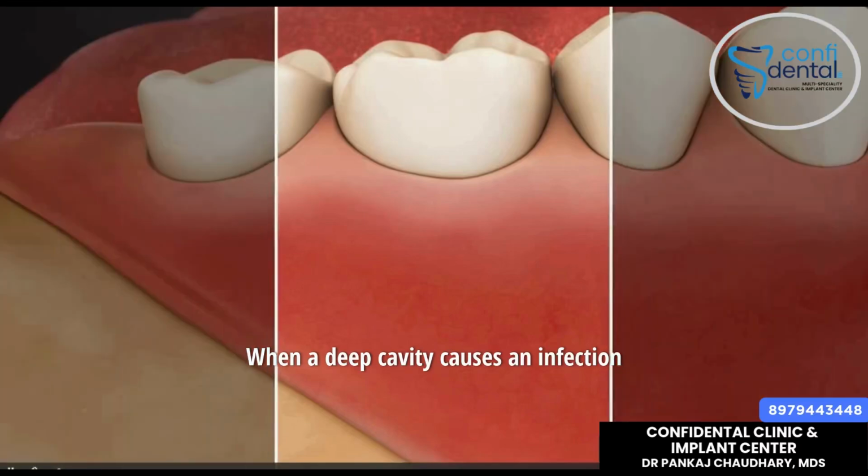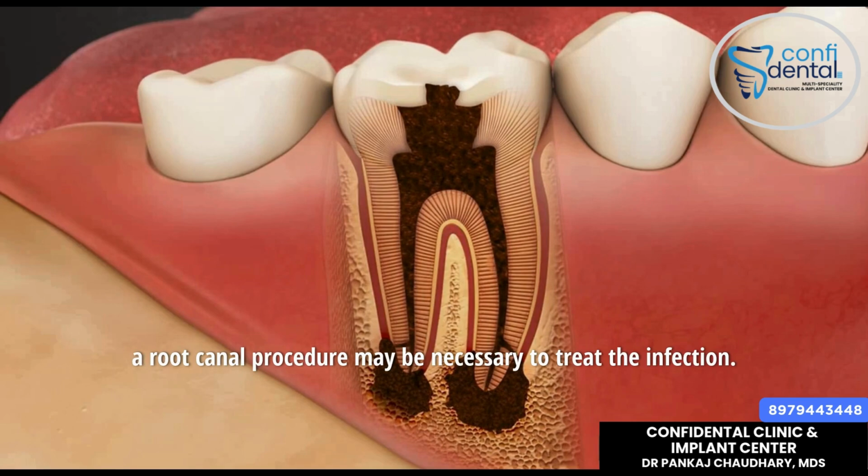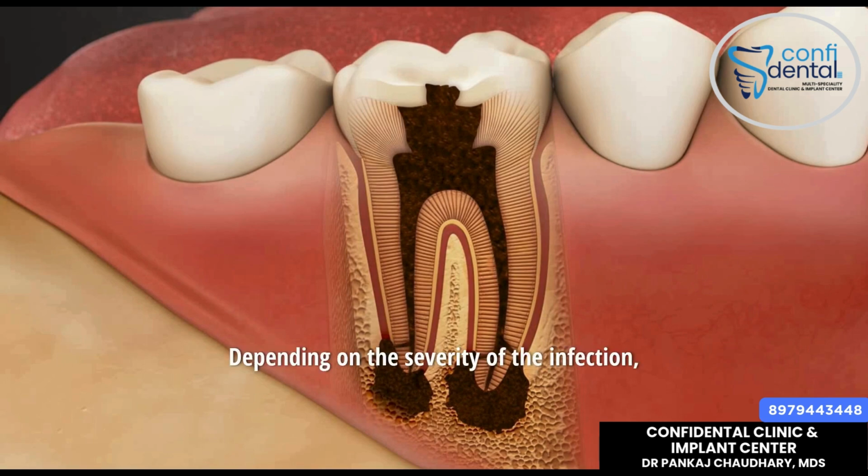When a deep cavity causes an infection in the blood and nerve supply of a tooth, a root canal procedure may be necessary to treat the infection. As a result of this deep infection, the tooth can become severely painful. Depending on the severity of the infection, you may experience varying levels of pain and may require more than one visit, not including follow-up visits.